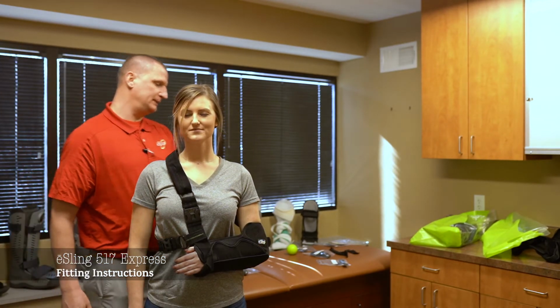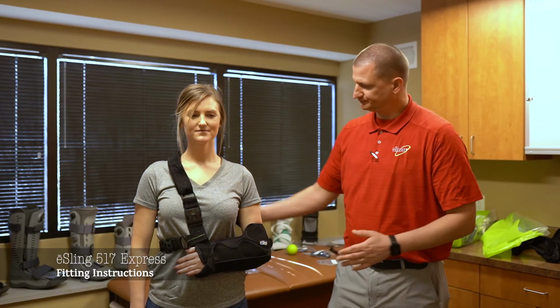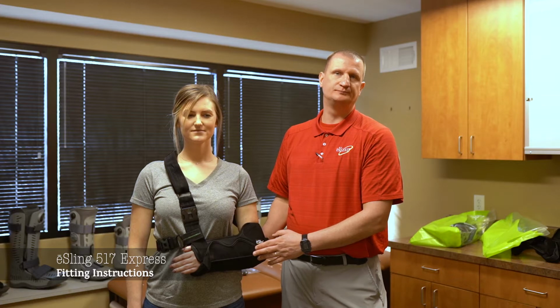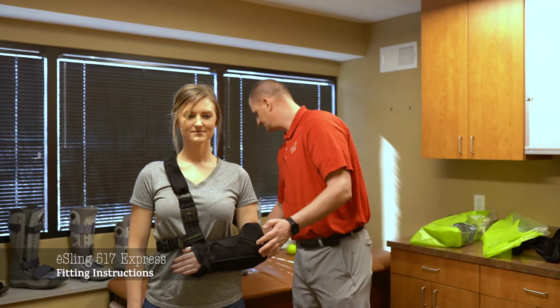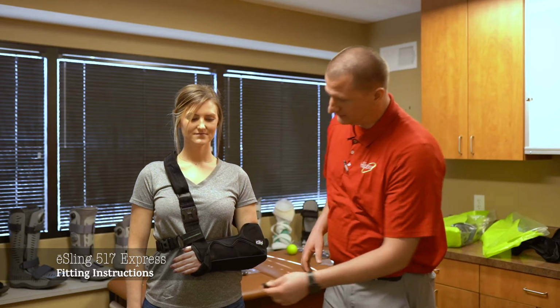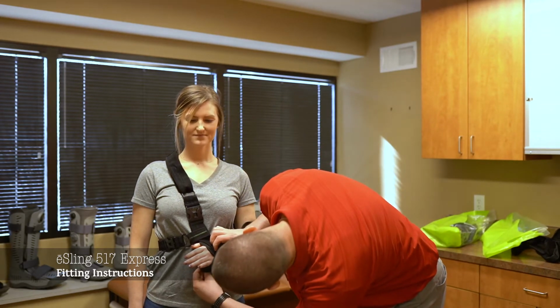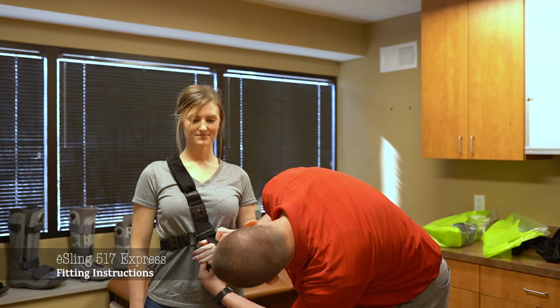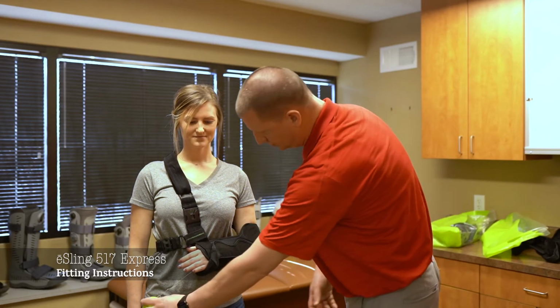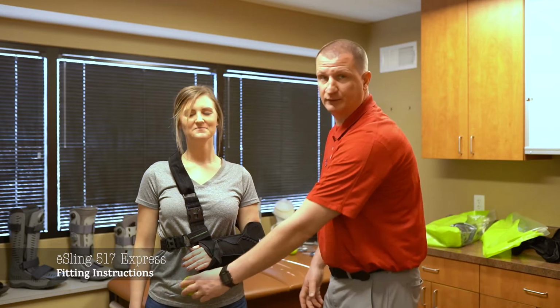After this is complete with the cross strap and the waist strap, we can add on our accessories. One of those accessories being our ball on the reel. That can just go on the inside of the sling so the patient can get to it. She can even bring it to this hand with her other hand.